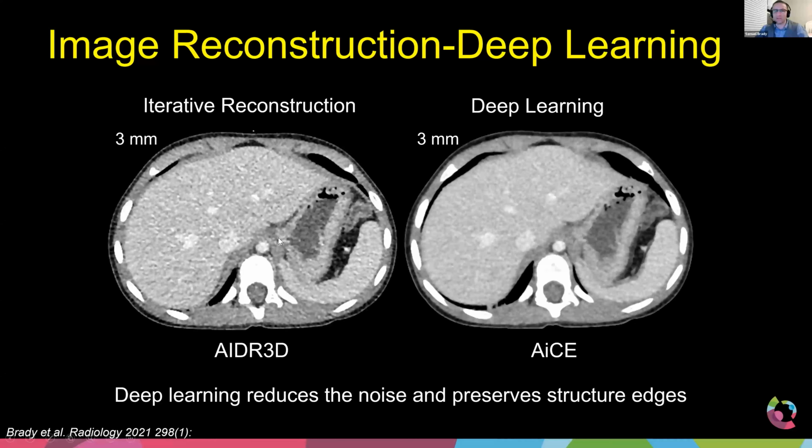kind of borderline low. We have historically, Tanya's a pediatric radiologist, and we got Panrutai, we got all these other pediatric radiologists, said radiation to kids is bad, so you poor radiologists have to look at really noisy images. That's what we said about 20 years ago. So our poor pediatric radiologists have gotten used to looking at really noisy images. Now, would they prefer to look at less noisy images? Probably. And so do we absolutely need to go and immediately turn down the dose? Probably not.